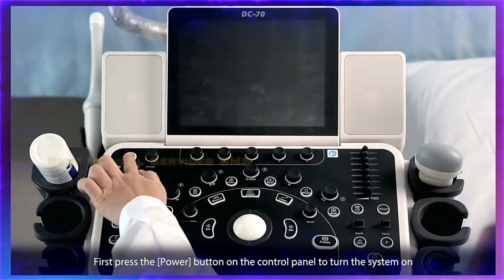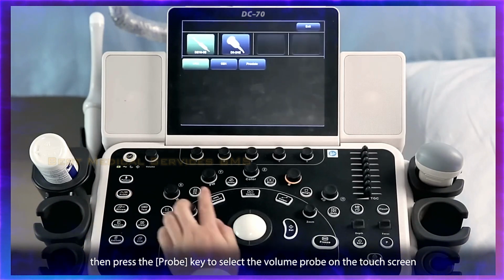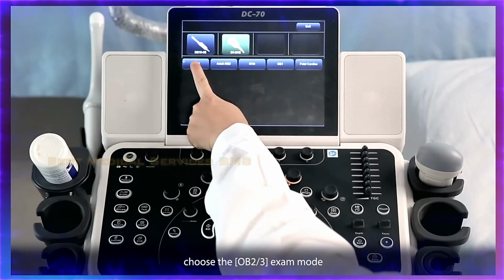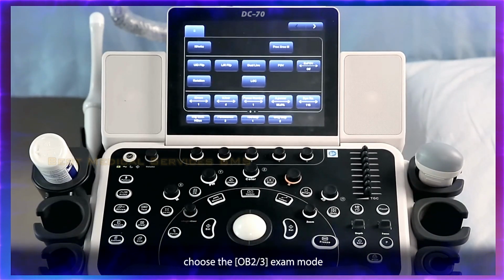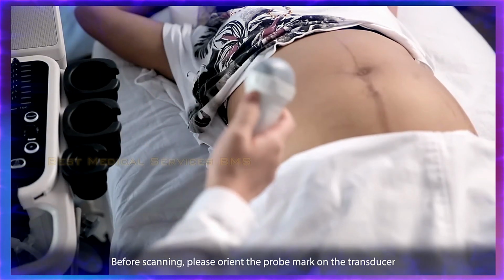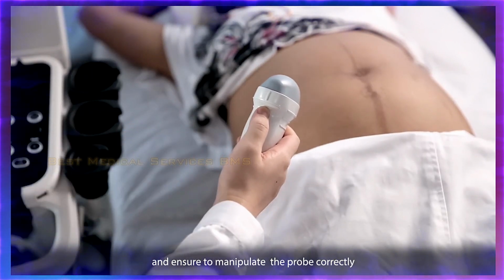First, press the power button on the control panel to turn the system on. Then press the probe key to select the volume probe on the touchscreen. Choose the second or third OB trimester exam mode. Before scanning, please orient the probe mark on the transducer and ensure to manipulate the probe correctly.